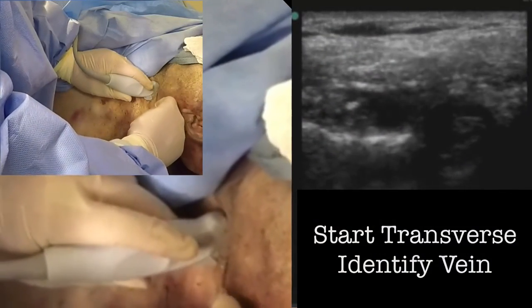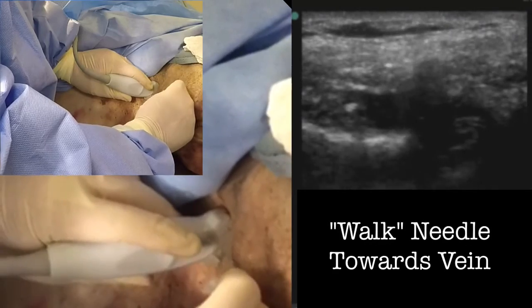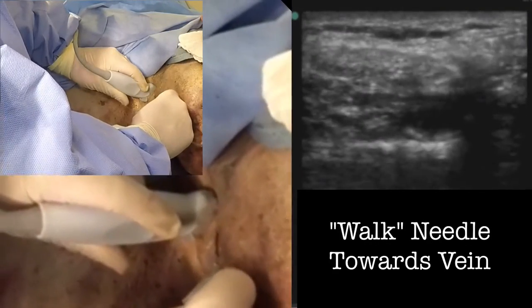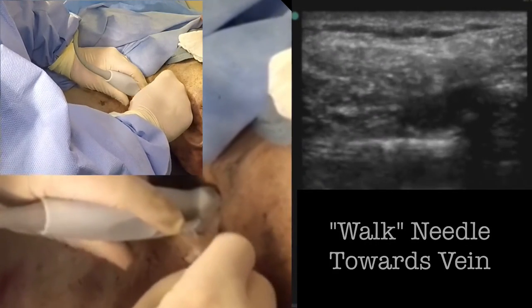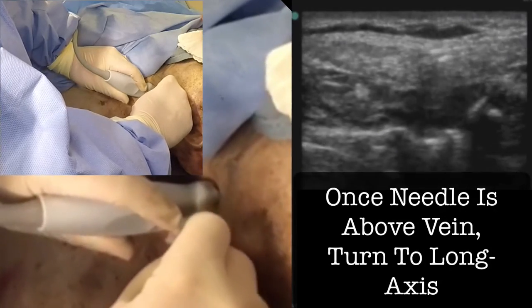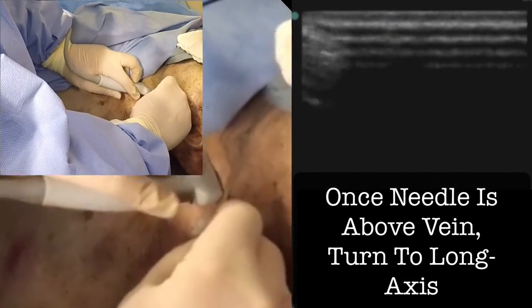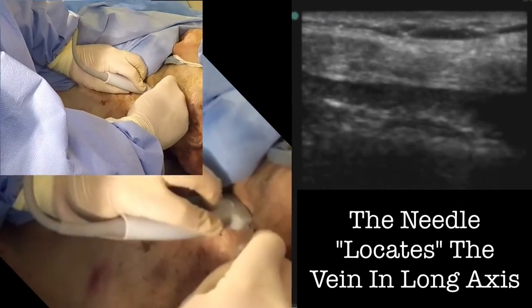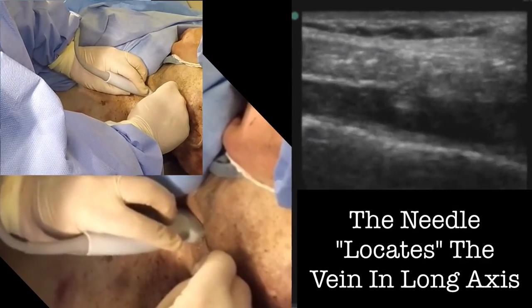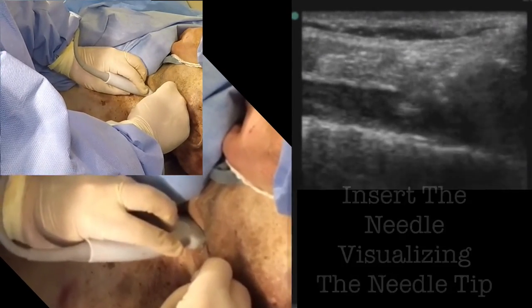In this video, you can see how difficult it is to see the needle in short axis. However, we can tell that the needle is just above the vein, and when we switch to long axis, we can see the needle in its entirety and guide it down into the vein and not penetrate the posterior wall.